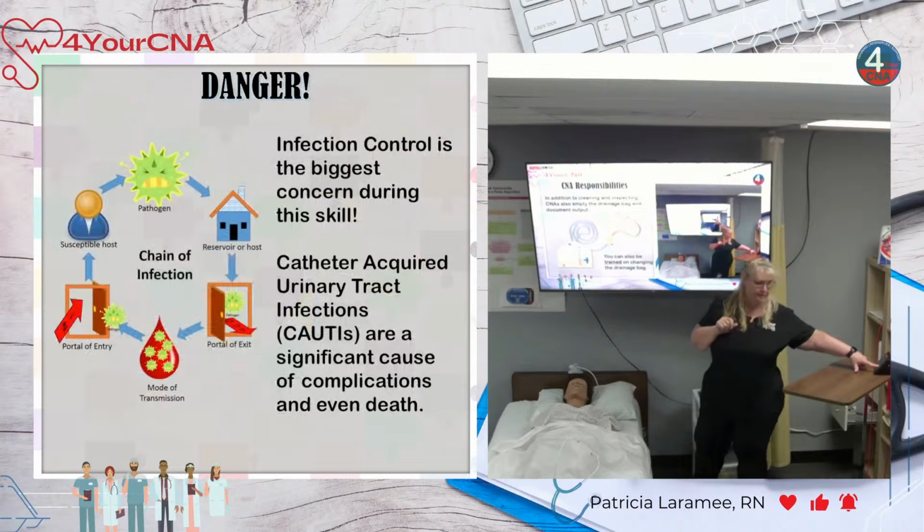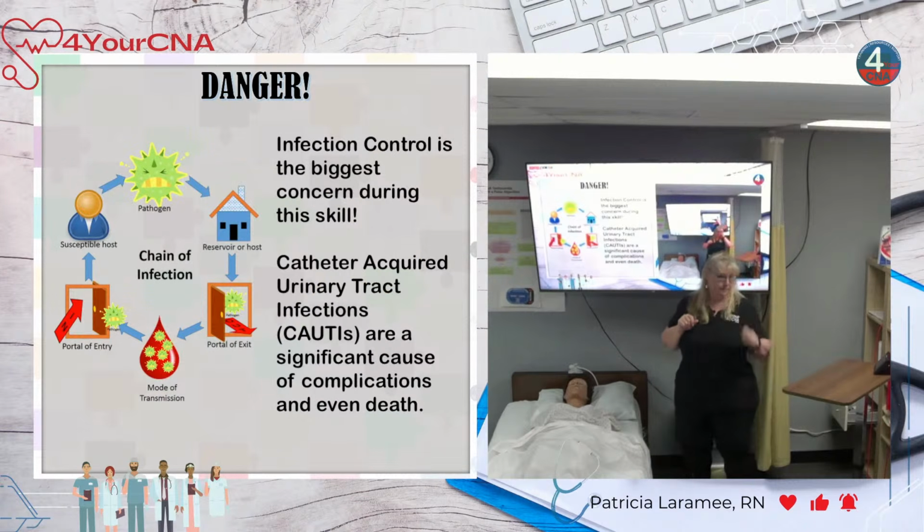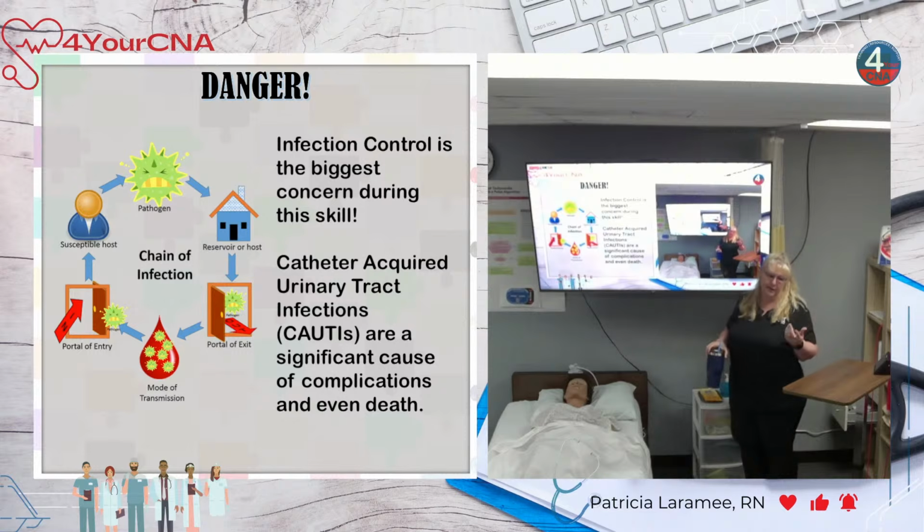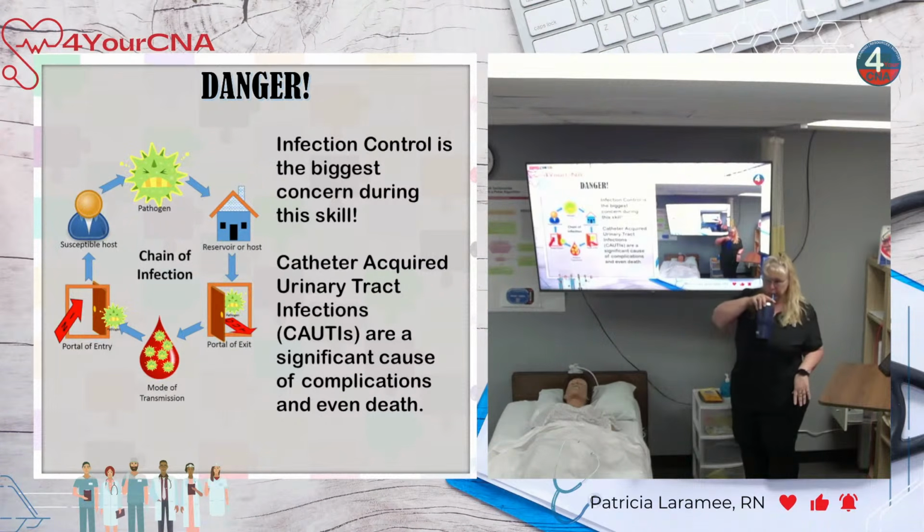What about if air got in that also? Air's fine. It won't cause a clot. No, air is fine. Air does not impact this system at all. Not like you're thinking of IVs, but yeah, it does not affect the system at all.